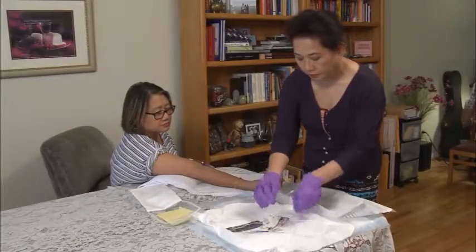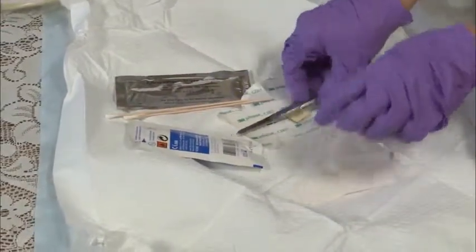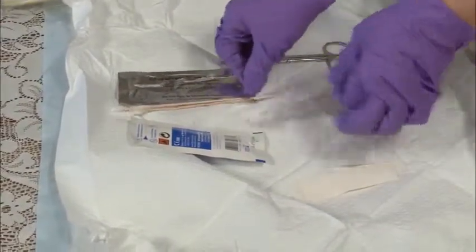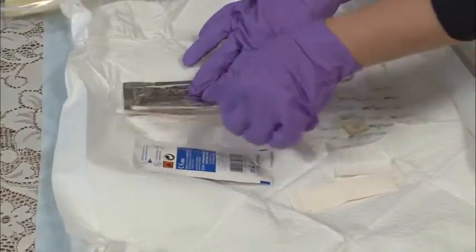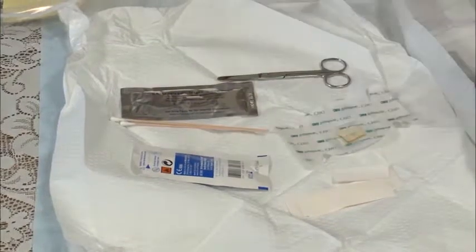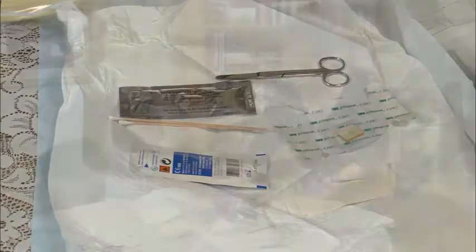Look at what's inside the dressing kit: 2 Q-tips, a package of antiseptic swabs, extra tape, label, scissors, a protective skin barrier film swab, and a transparent dressing with antiseptic gel pad bandage. Lay them out so you can work easily with them.